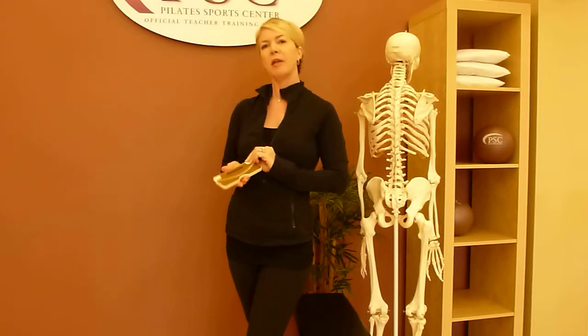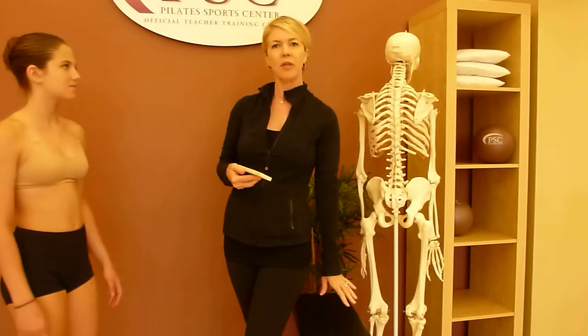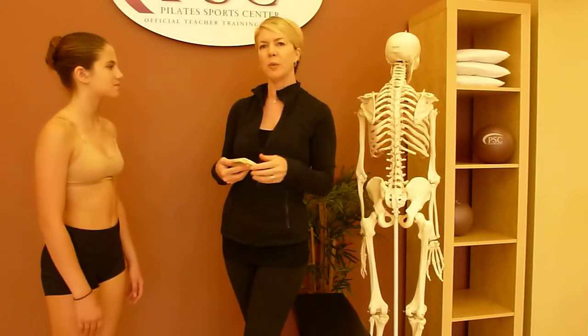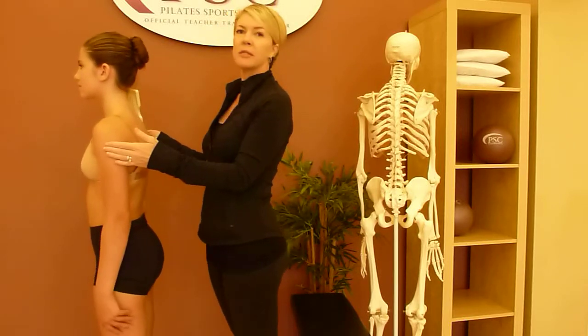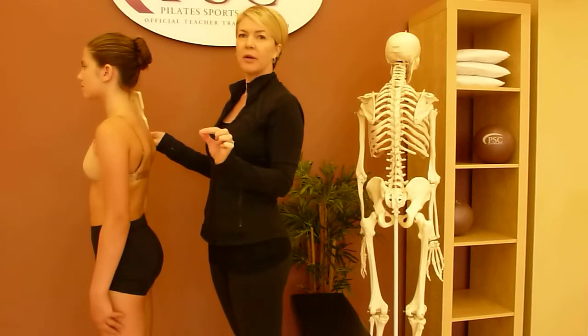Today our lovely model is Samantha, who's going to be helping us demonstrate how this works. I have a seat here so that I can get a nice bird's eye view as we work. We're going to begin with her back to us, feet exactly hip distance apart or squeezing together completely.